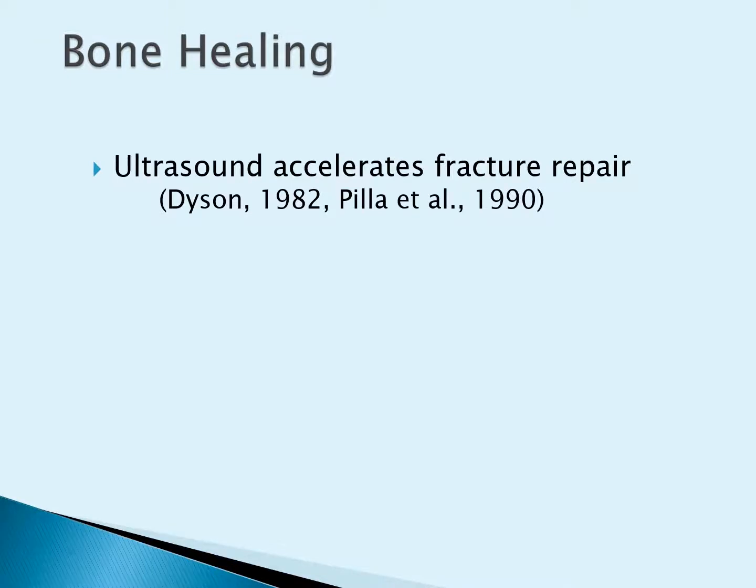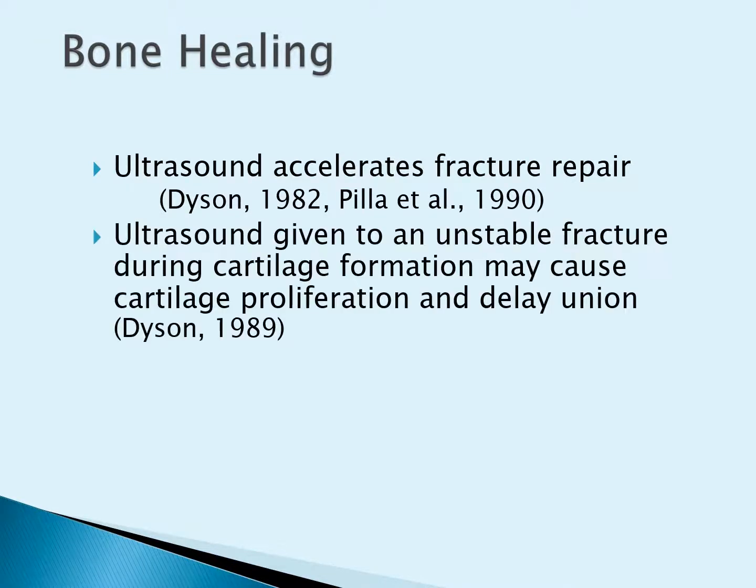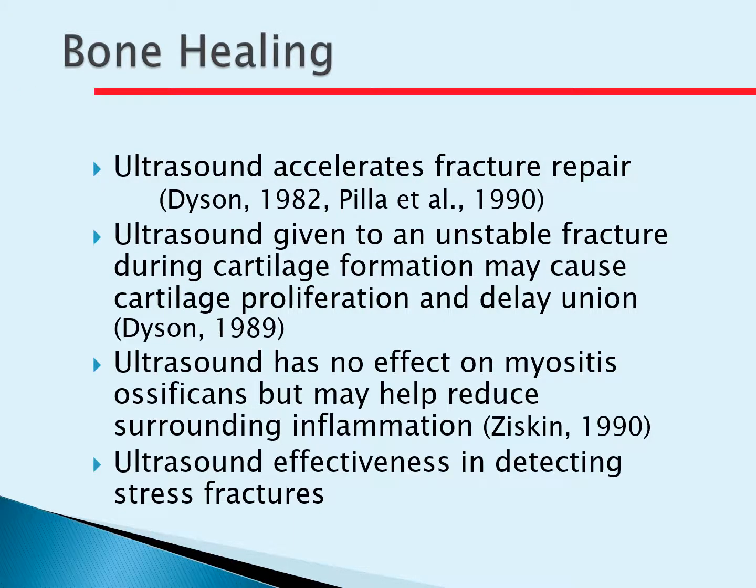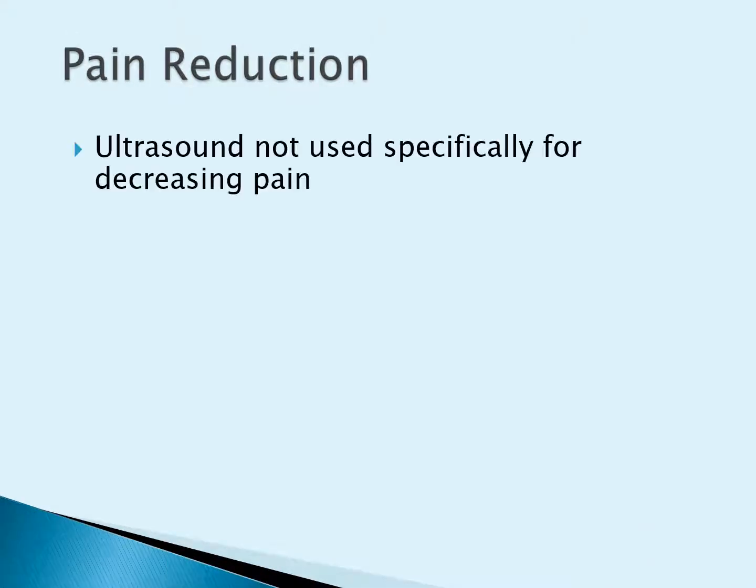Bone healing. Ultrasound does increase fracture repair once that callus has formed. So that means we have to have a functional callus at that point, otherwise we can cause cavitation at the bone and it can be painful. It can also be effective in detecting stress fractures, because if we use ultrasound on a bone that we think might have a stress fracture, usually they're going to let us know it's a fracture because of the pain.